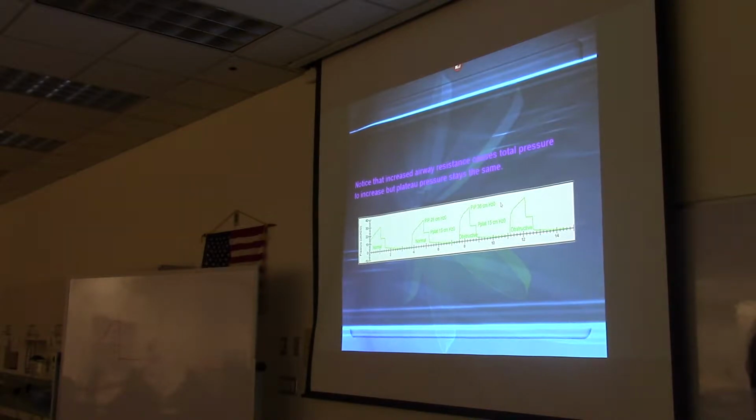And how did you know that? The plateau pressure stayed the same. Very good. Plateau pressure is the same. So we know that the alveoli didn't change, because the plateau pressures are the same. But if peak pressure is higher, now we think, all right, maybe they're in bronchospasm, maybe we need to suction the airway. Something's going on in the airway that's making the pressures go higher.